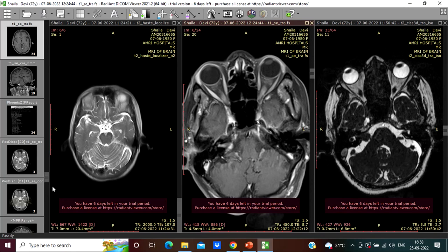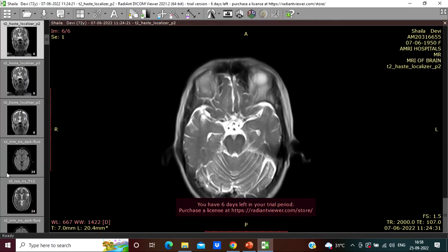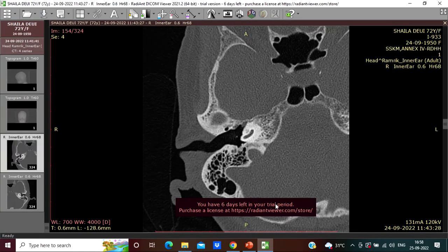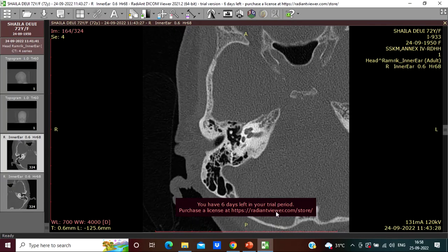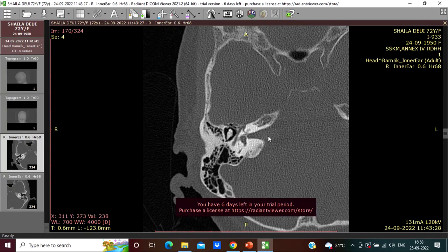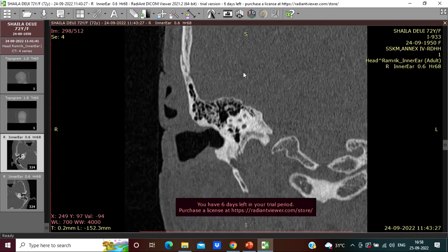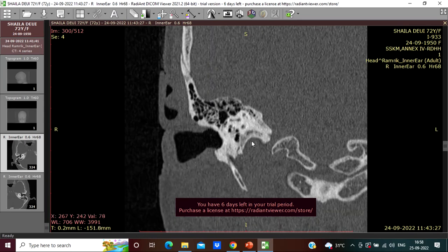Now, in order to reach this, how much? Now is the role of CT scan for the access. Now, see. We are going to reach this tumor. The tumor is here. Our dimension of the temporal access. See this. This is above, and anterior and posterior. See, we have this much of access to address this tumor. Now, superior inferiorly, see, this is your jugular bulb. This is your jugular bulb. Yes.